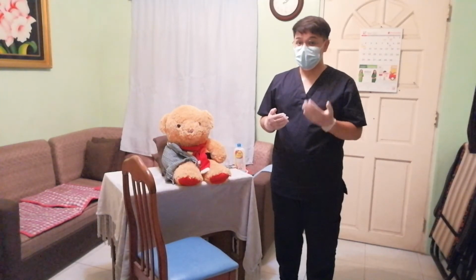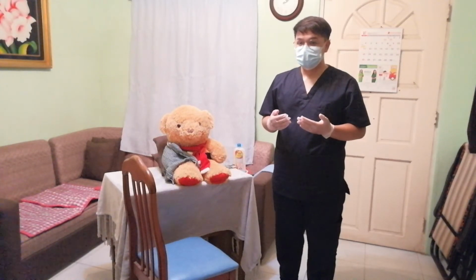We need to ask the patient to use his or her arms to steady him or her on the arms of the chair, while slowly lowering him or her to a sitting position.